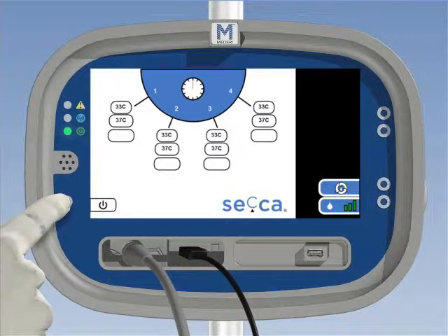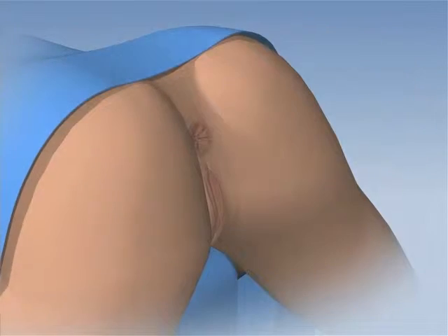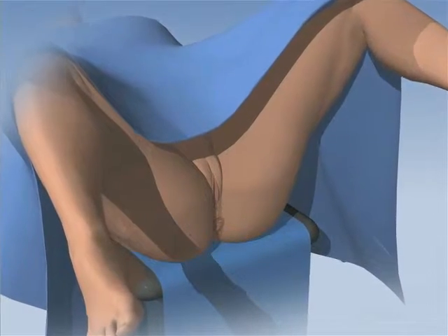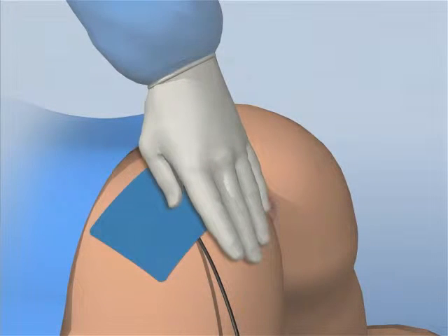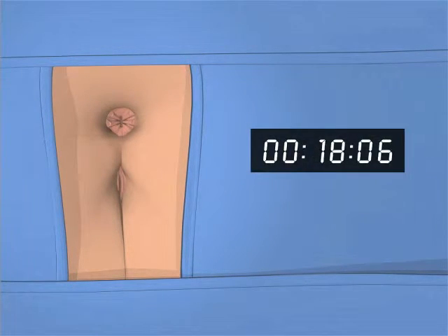After patient preparation and prior to first treatment, push the power on mode button to progress to the ready mode. The physician may elect to modify these suggested steps for patient preparation. The patient administers one to two enemas one hour prior to the procedure. Position the patient in the prone or lithotomy position. Prepare the patient using the standard technique for monopolar electrosurgery. Apply the dispersive electrode pad to a cleaned and hairless area on the patient's buttocks. The area must be clean and hairless to ensure proper electrical contact. The type of sedation or local anesthesia is at the discretion of the physician. If necessary, monitor patient vitals and be sure to allow enough time for the anesthesia to take effect.